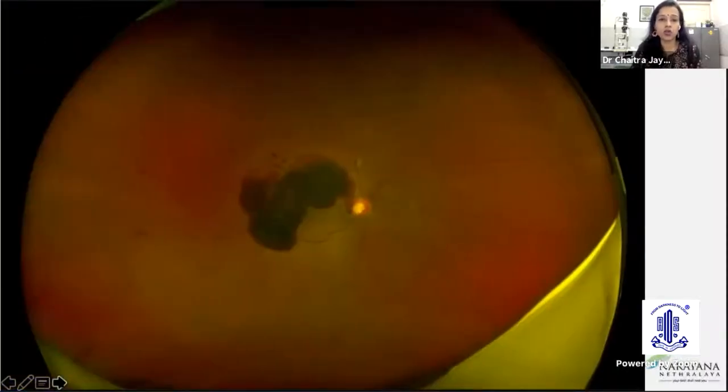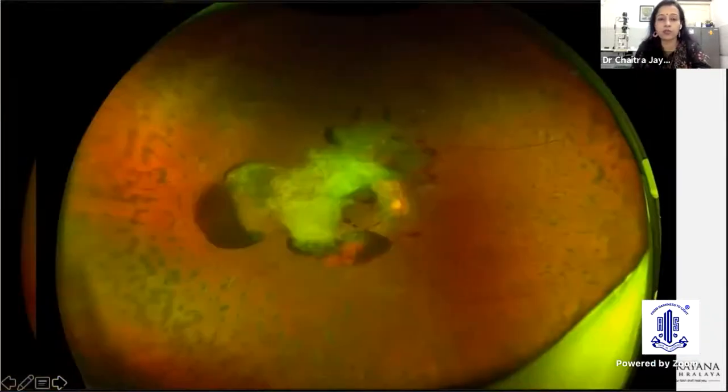Now, this is a patient that I saw. It looks very ominous when you see it at the first go. Here you can show the patient, now this is why your vision is so low. You have a huge clot right in the center of your visual field, which is why your vision is poor. The rest of the retina may look very innocuous to him, but then you can explain, you can show the sclerosed vessels, you can show the proliferative diabetic retinopathy.